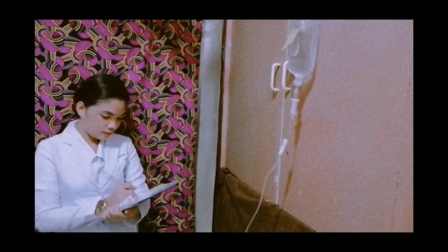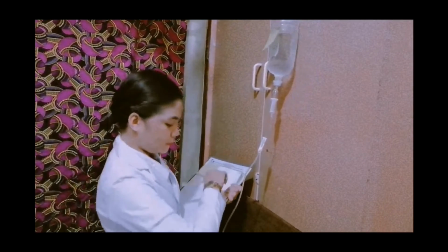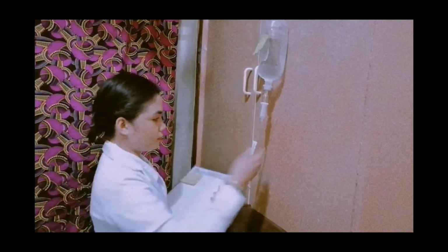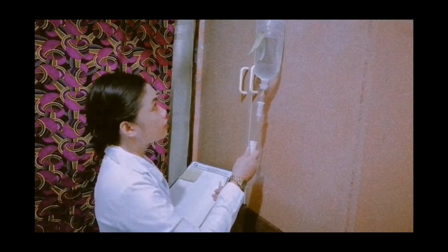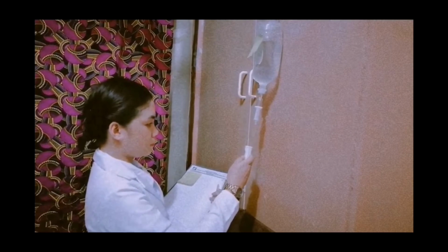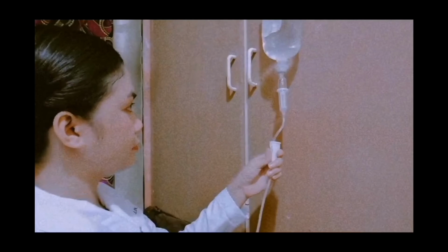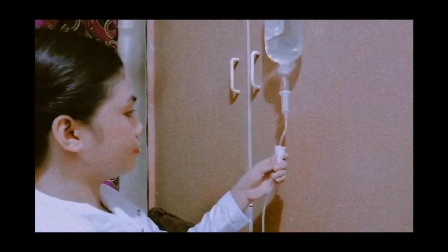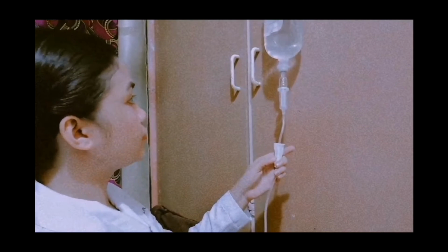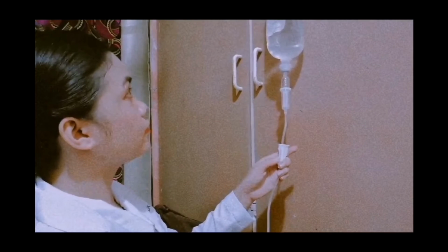Next is to count the drops per minute in the drip chamber. Hold the watch beside the chamber. Holding the watch next to the drip chamber allows the eyes to focus on the drop and the second hand on the watch to provide an accurate count. Next is to adjust the IV clamp as needed and recount the drop per minute. This regulates the flow rate into the drip chamber.